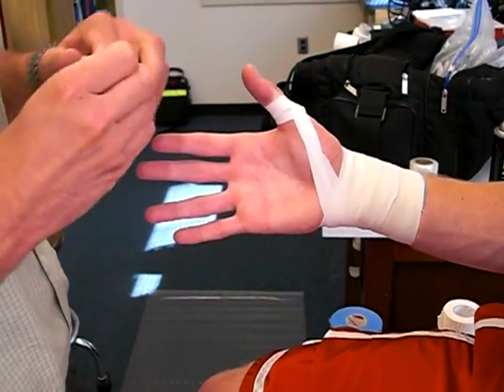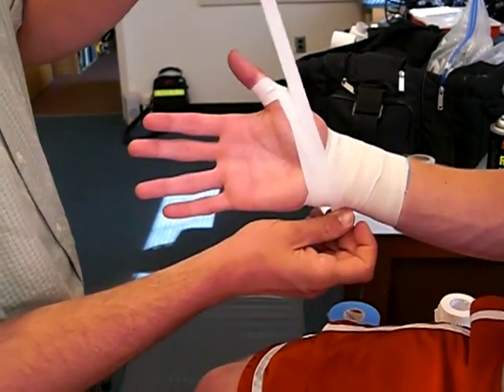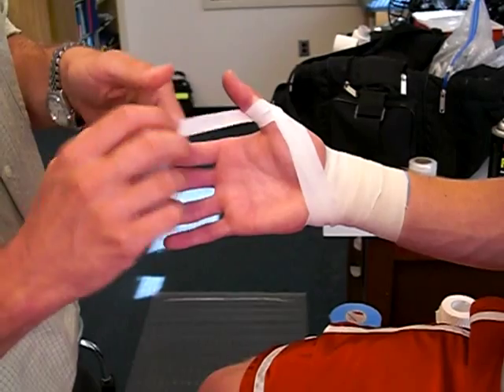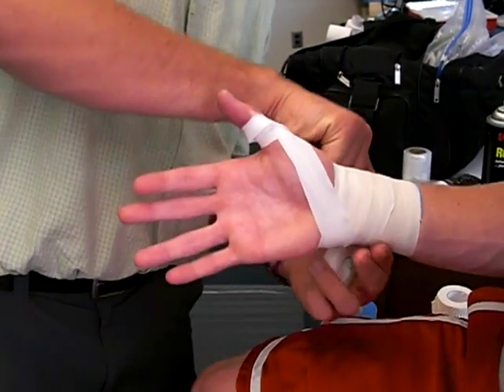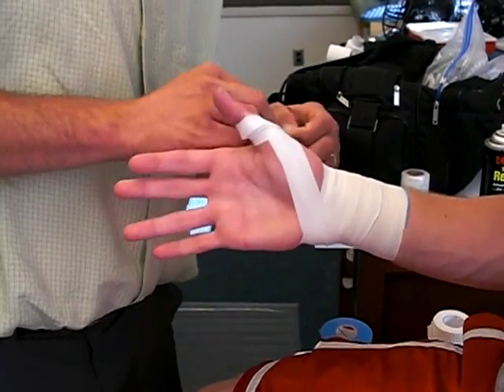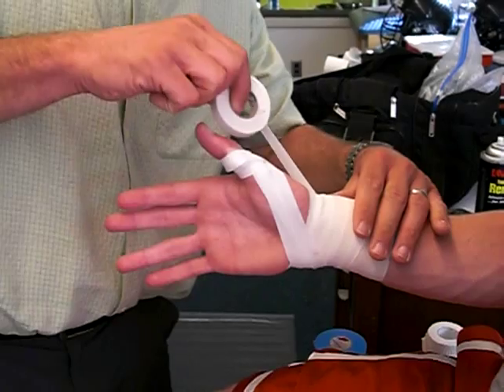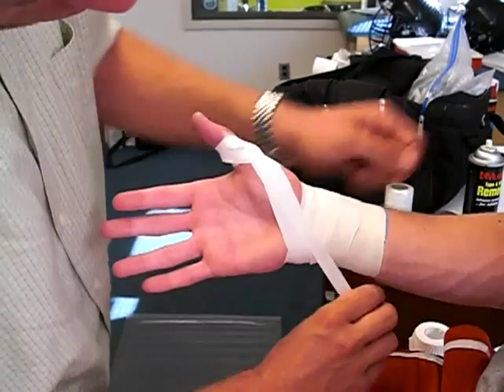The other way you can do it is you can start up here, come around, and then pull down. That's fine too. There's no real wrong way as long as you're making it functional. Pull around this way, come down that way — either way works.